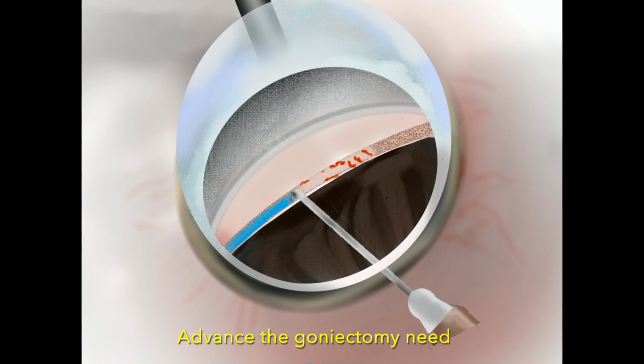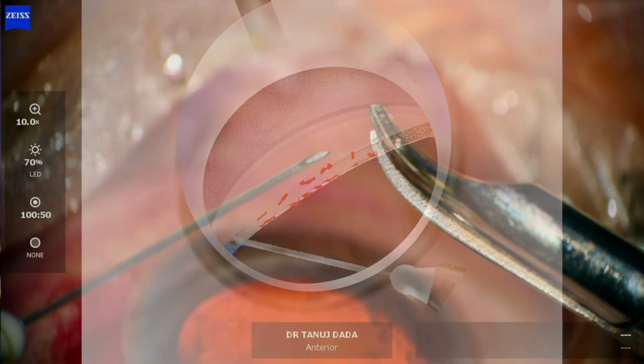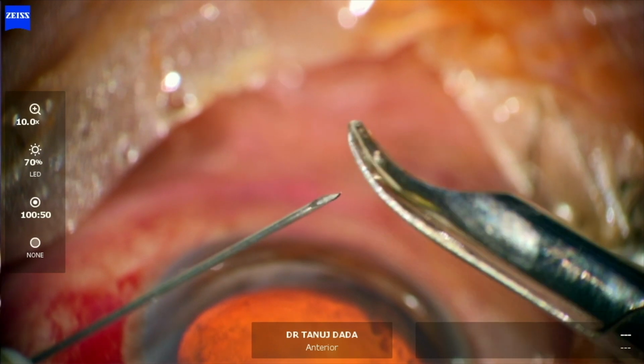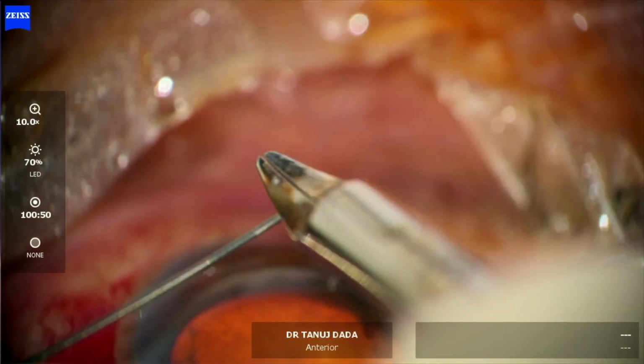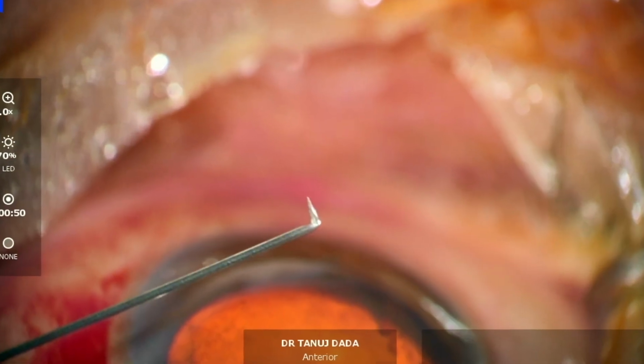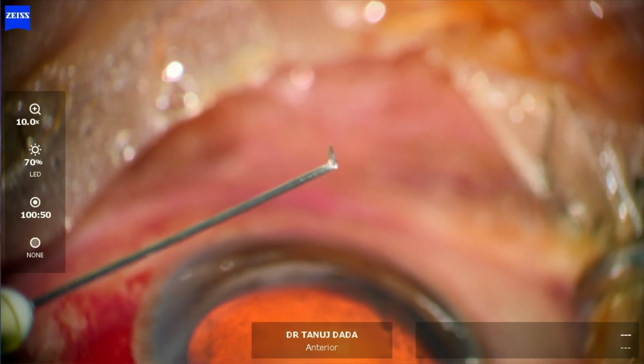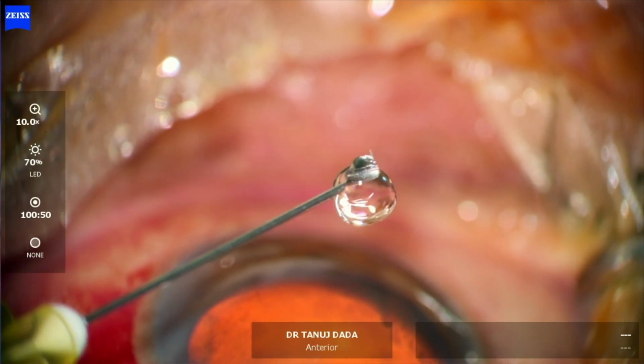To make the goniectomy needle, use a needle holder to bend the tip of the 30 gauge needle at the end of the bevel. The bend should be almost 90 degrees and the bevel should face the surgeon. This needle is then attached to a syringe of visco-cohesive agent and the plunger is pushed to check the flow.